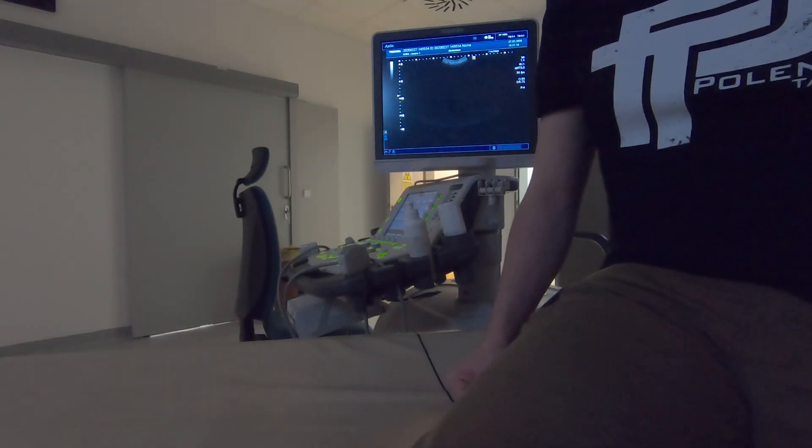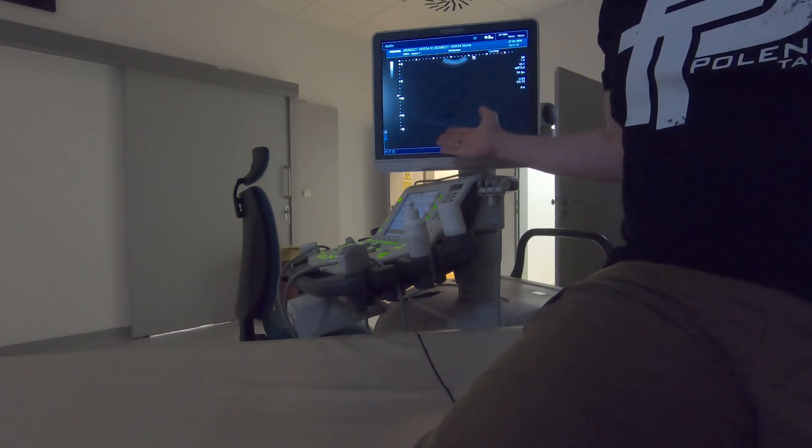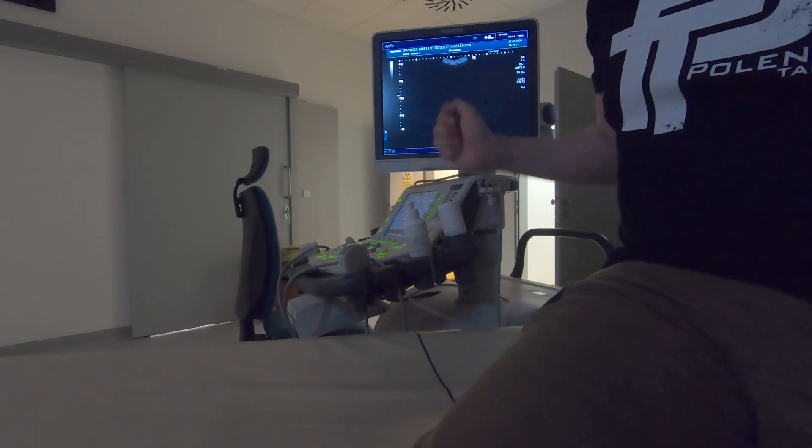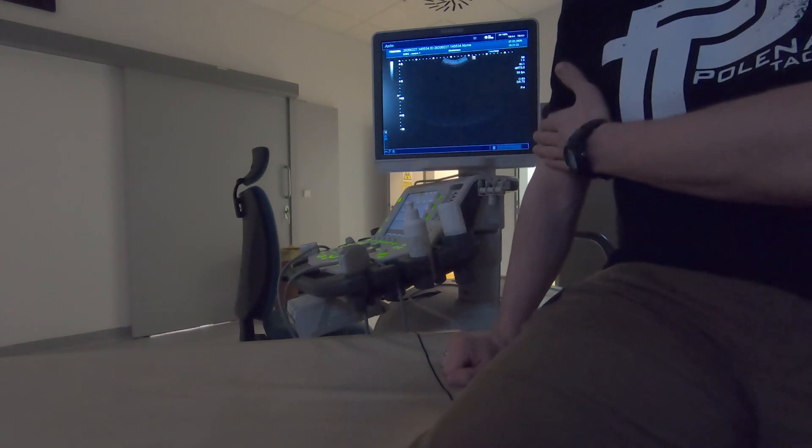So here we are in our testing facility, where we will perform the test with a Toshiba APO 500 with real-time Doppler screening on both lower and upper extremity.